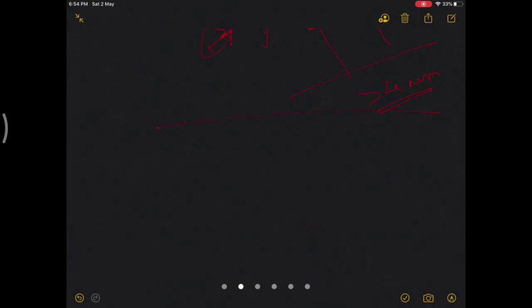And the other thing is of course the PCL is a ligament which has mechanoreceptors, and it is involved in proprioception. So patients postoperatively feel more of a native knee in cruciate retaining than in posterior stabilized. And the other thing is there is something called patellar clunk syndrome.